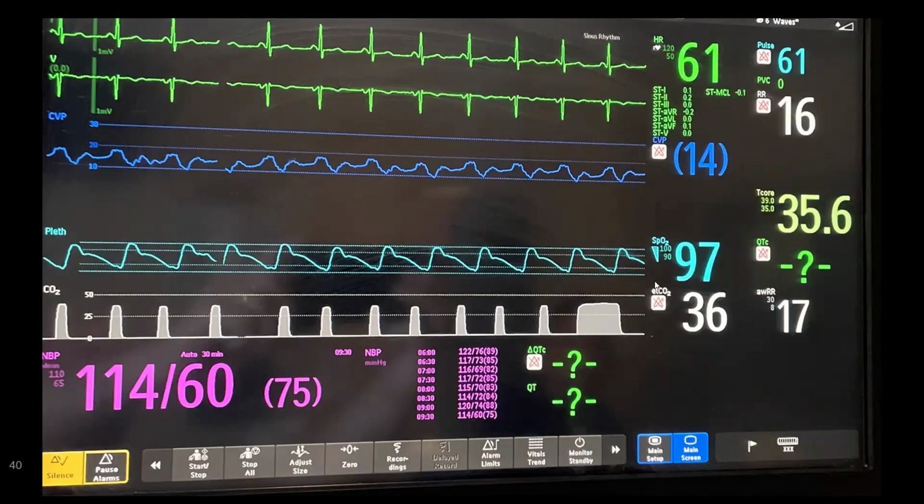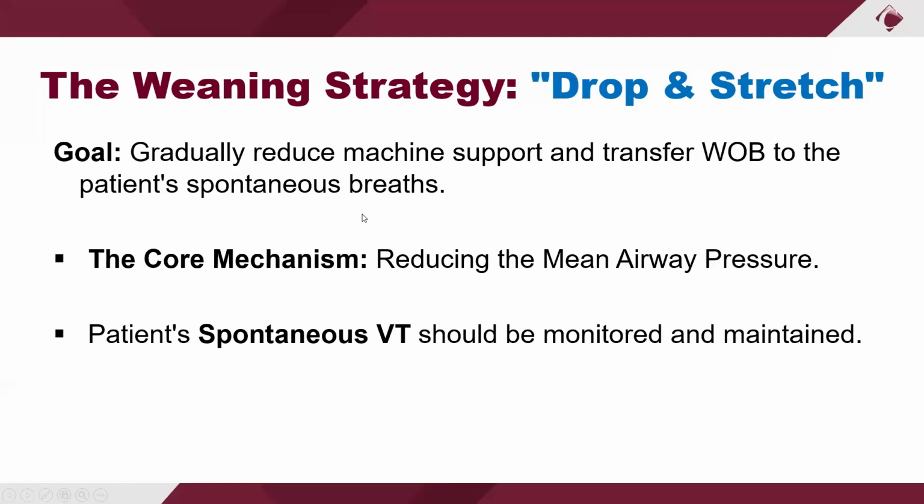We did a hold. So we actually did an expiratory hold where we were measuring, in that screenshot, the intrinsic PEEP to see what kind of PEEP we were trapping. And look at that, I got a full capnogram. So again, just other things I want to share with you guys. The end-tidal is only going to spike right here at the end, right? The number is just going to spit out whatever the end-tidal is. But if you had a lower airway obstruction, then this would look more like a shark fin coming out, right? So here you wouldn't be able to tell if there was a shark fin. But if you did an expiratory hold just to observe the capnogram coming out of there, you'd be able to look at that and go, oh, okay, I've got some lower airway issues there. So, little things to do at the bedside.